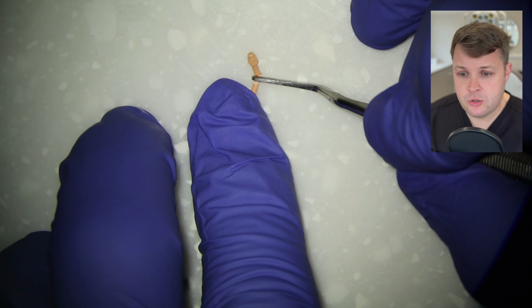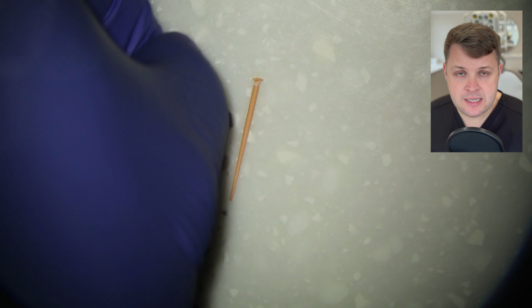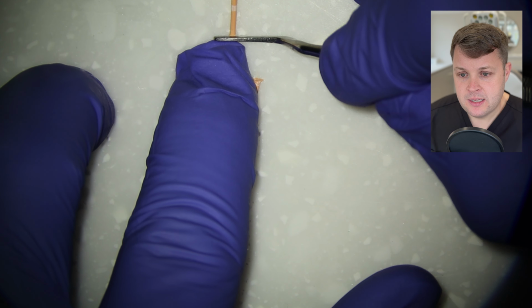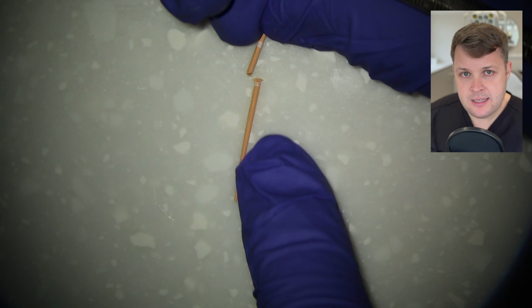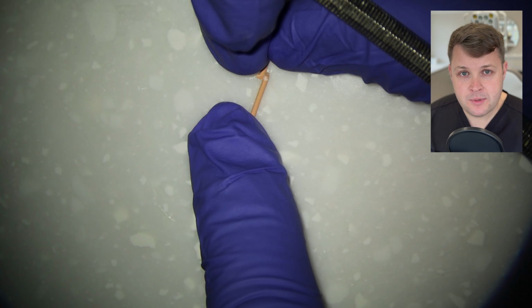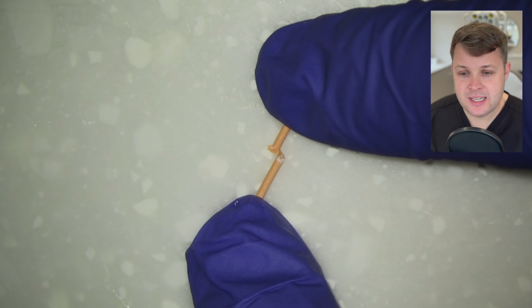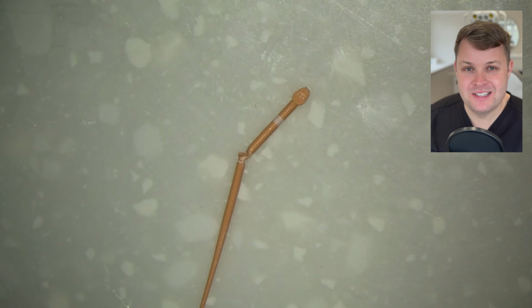The first one I'm going to cut almost off at the end, and then I'm going to place another cone next to it, and cut this a little bit further down. And what I'm going to do is splice these 2 pieces together, so the ends together. The way I'm going to do this is I'm actually going to melt the two GP cones together using my heated plugger, although it is a tiny bit fiddly getting the little pieces together.